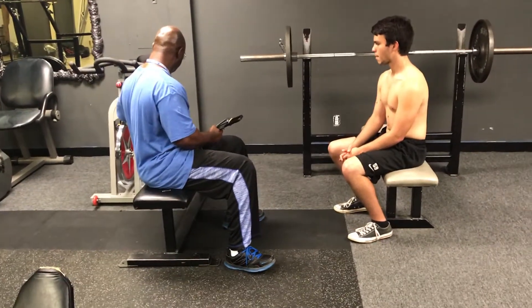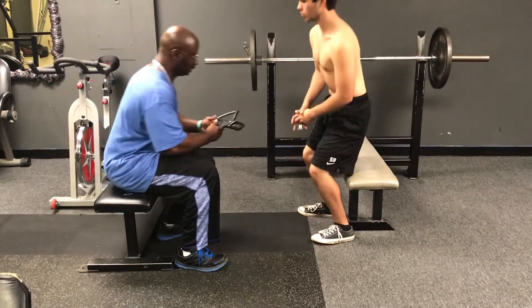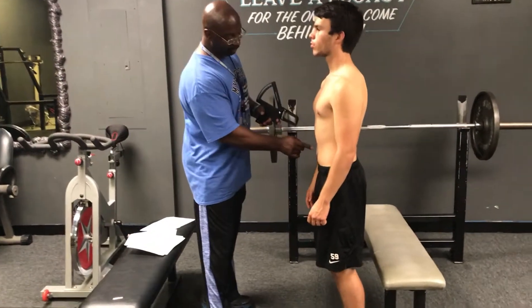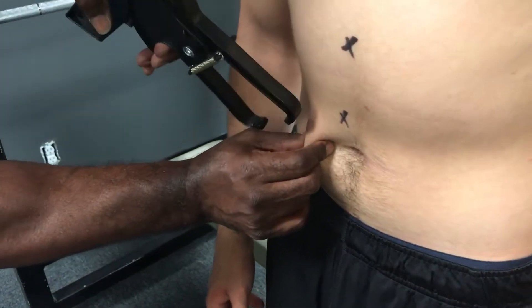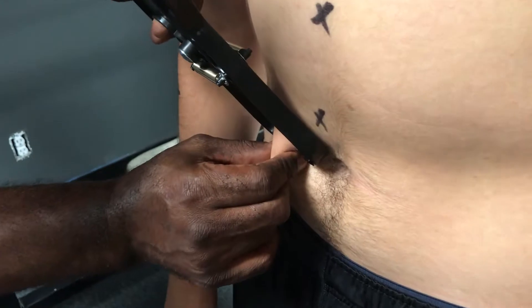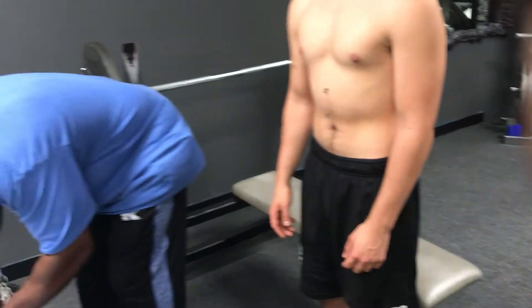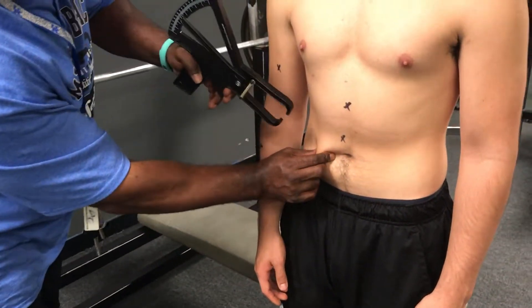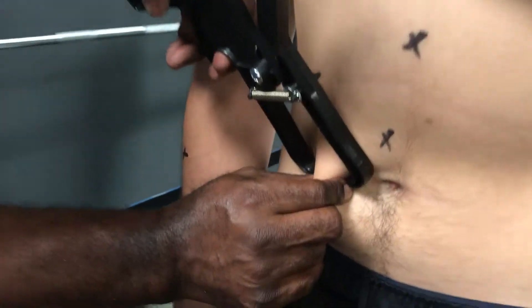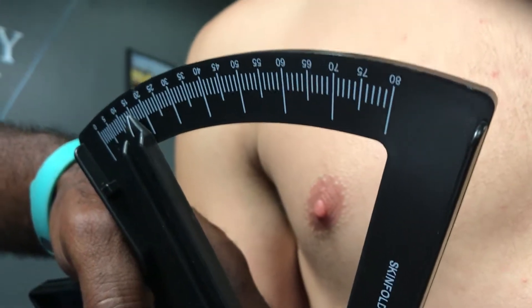The first measurement is your abdominal — two centimeters to the right of your navel, right about here. I'm going to do it twice. The first number is 18, and the second is 16.